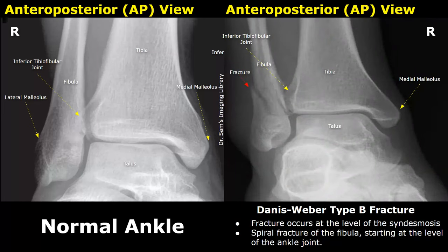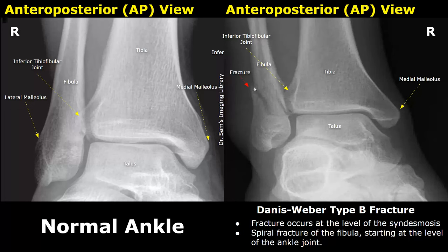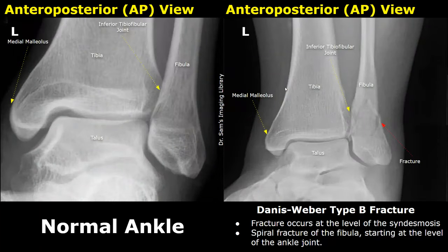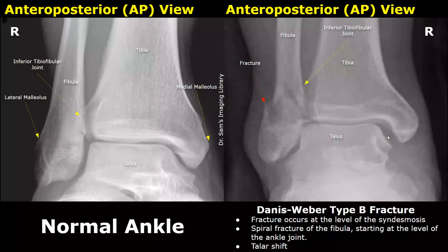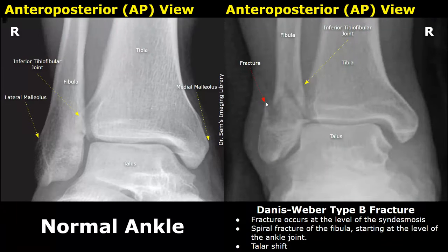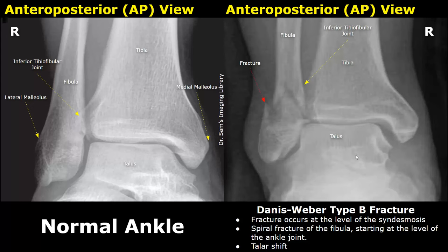A Danis-Weber type B fracture occurs at the level of the syndesmosis and usually consists of a spiral fracture of the fibula. This fracture is at the same level as the syndesmosis. Here is another case of a Weber B fracture — the fracture occurred in the fibula at the level of the syndesmosis. In this more severe case, there is displacement of the talus as well, suggesting deltoid ligament tears. We can also see a wide medial clear space.